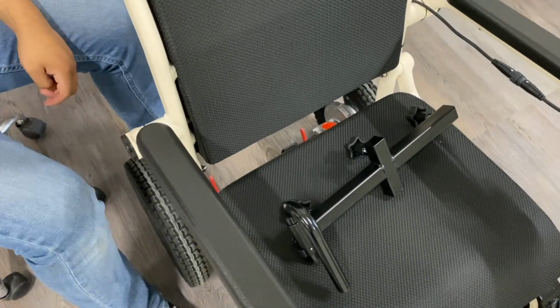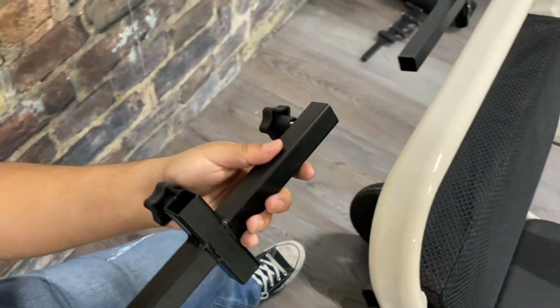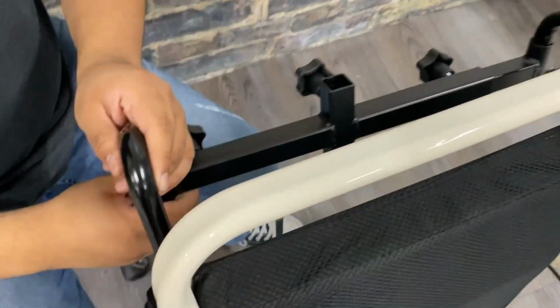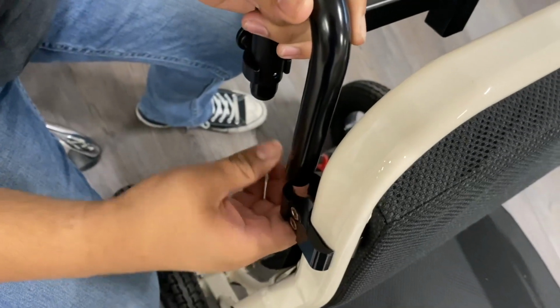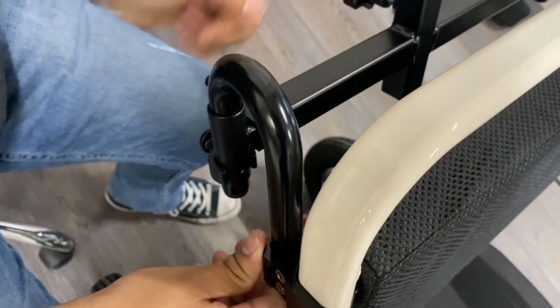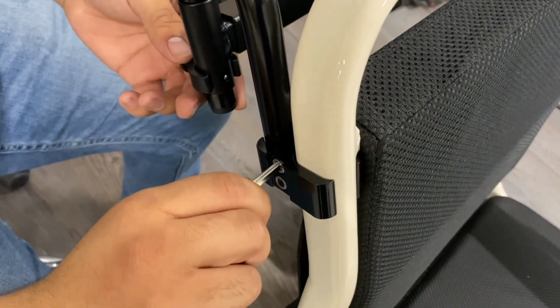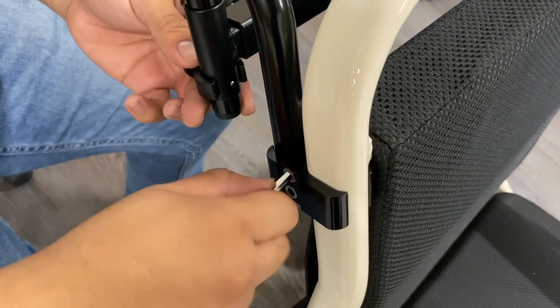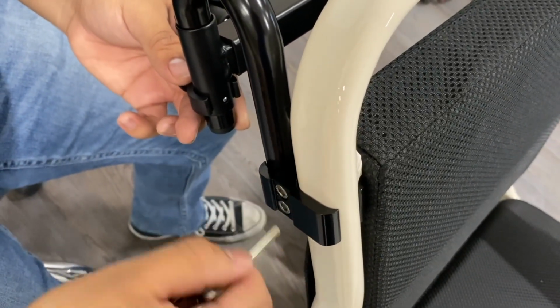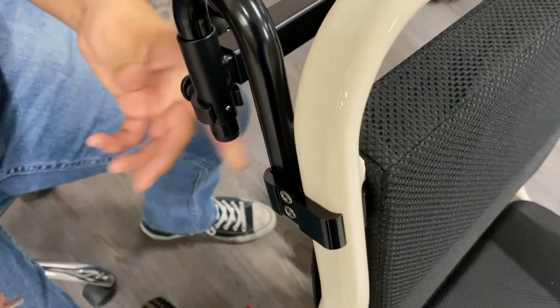Now it's time to take the U-bar and the crossbar. First thing you're going to do is slide the crossbar into the other U-shaped bar on the other side of the chair. Then take the right side U-shaped bar, put it into the hole of the C-clamp, and tighten it down. Once you tighten it, the headrest will not be able to move on your MagSHOCK chair. So you're going to tighten this completely until it's snug.